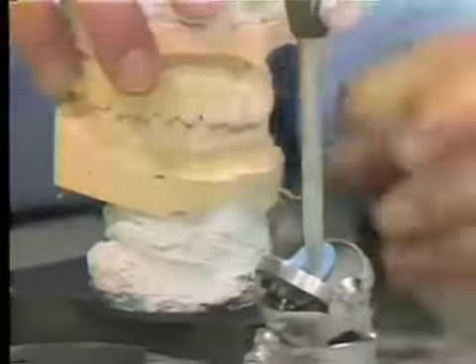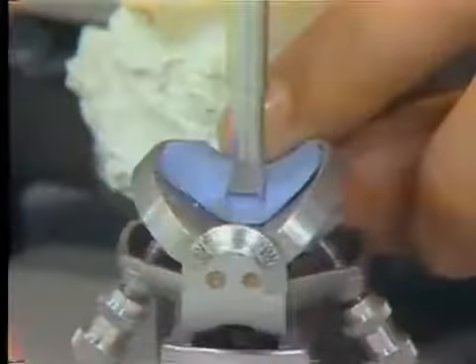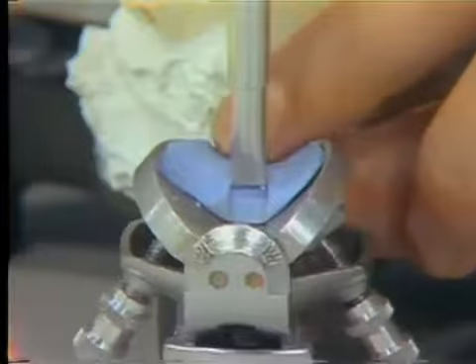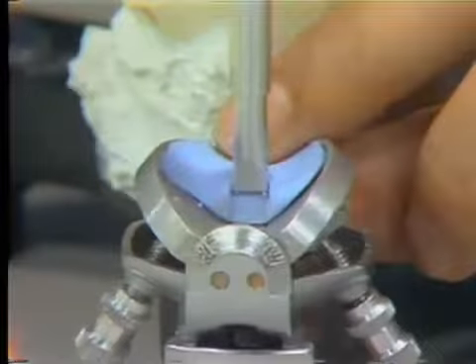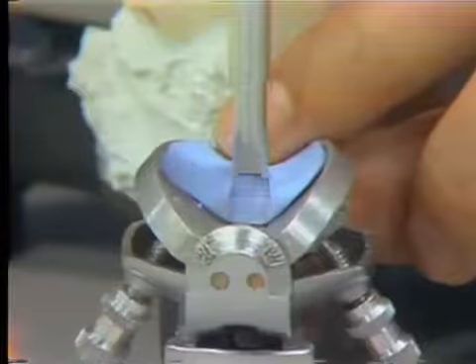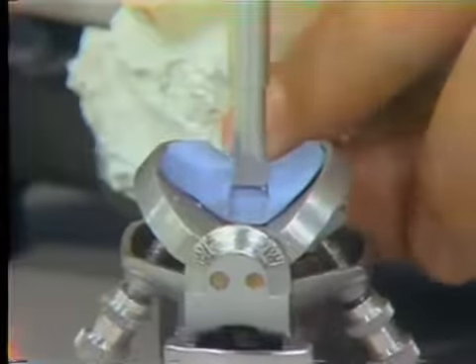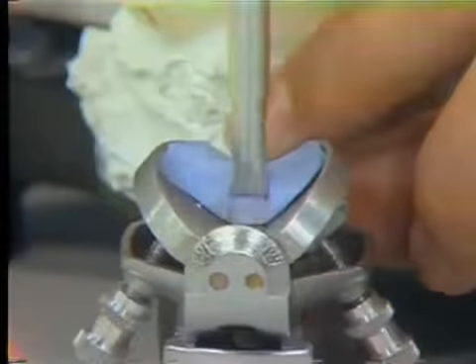Now, if we look down at the incisal table again, we're going to try to create a little plateau where it has gone beyond the end-to-end relationship. In other words, beyond this little plateau here, the teeth are no longer in an end-to-end relationship, and the maxillary teeth are actually going behind the mandibular teeth.